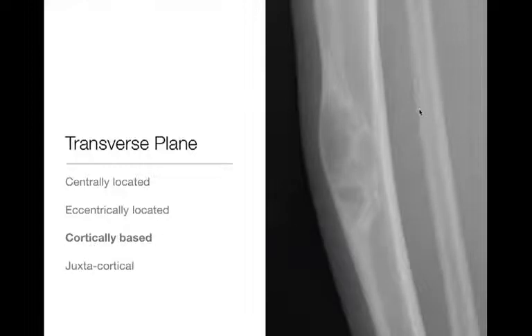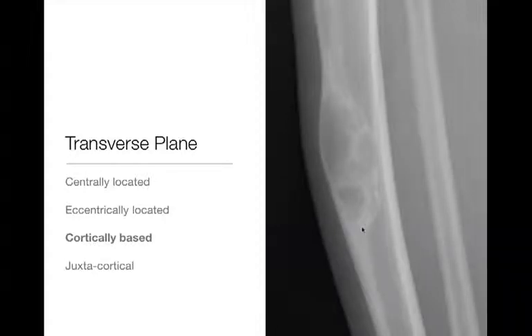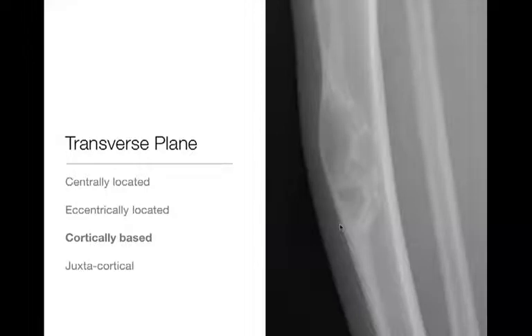Cortically based lesions are lesions that arise from the cortex of the bone. These can sometimes be difficult to distinguish from eccentrically located lesions — they may overlap in appearance. But this is a good example of a cortically based lesion arising from the cortex of the tibial diaphysis: a geographic lytic lesion, cortically based, with a narrow zone of transition and sclerotic border. This turned out to be osteofibrous dysplasia, which characteristically occurs within the cortex of the bone.